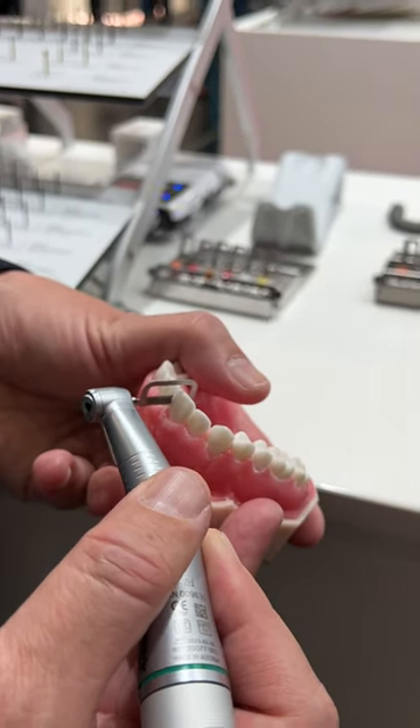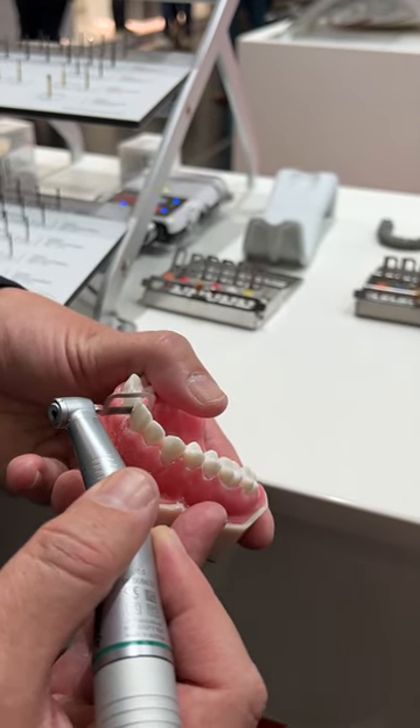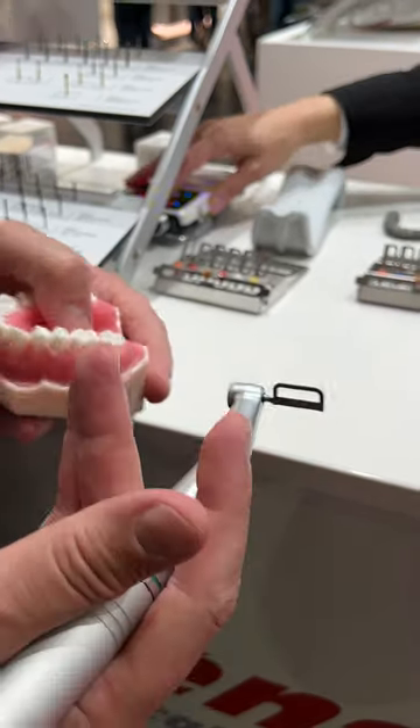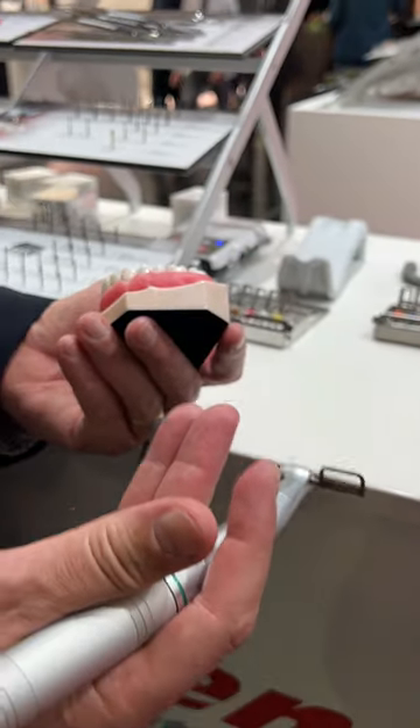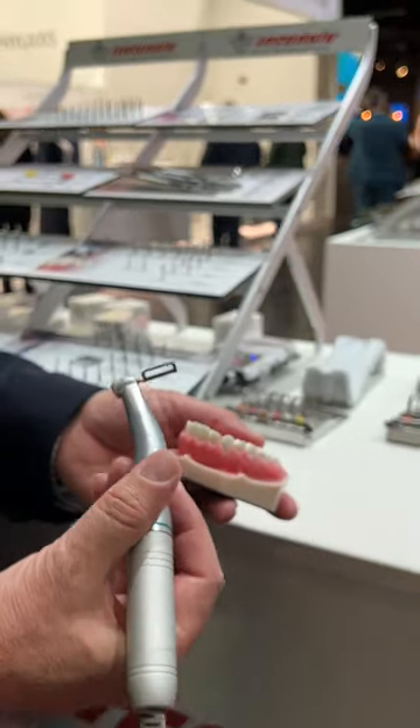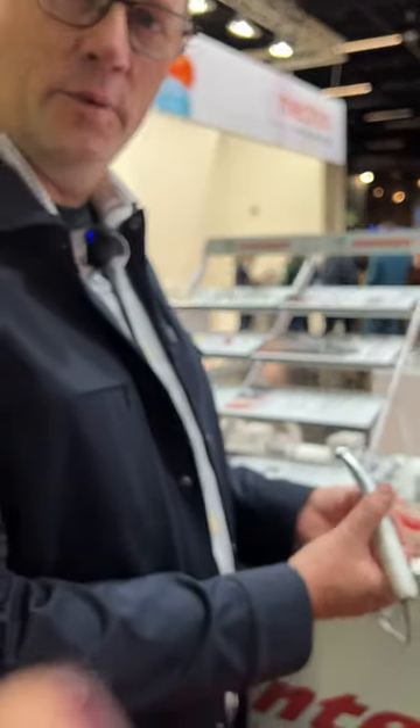I am using here the 40 micron, and in just a few seconds we can get the space that we're looking for. The 40 micron — for about 10 seconds you get 0.2 millimeters. And then easily, safely, in a reliable way, you get what you need.